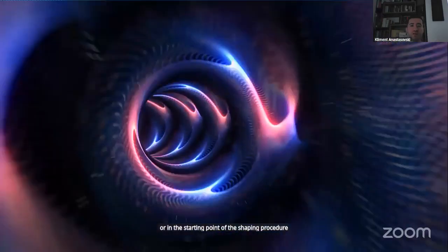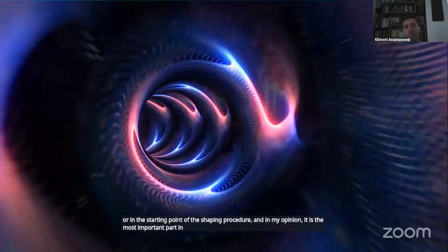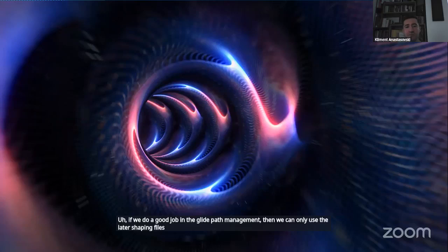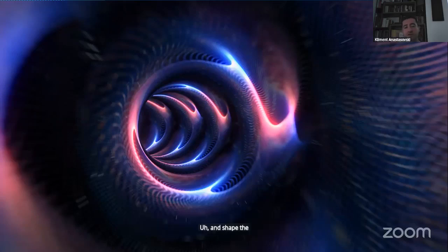In my opinion, it is the most important part of the shaping procedure. Why? Because if we do a good job in glide path management, then the later shaping files inside the rotary system, which are bigger in size than the glide path file, just follow its path and shape the root canal without any error.